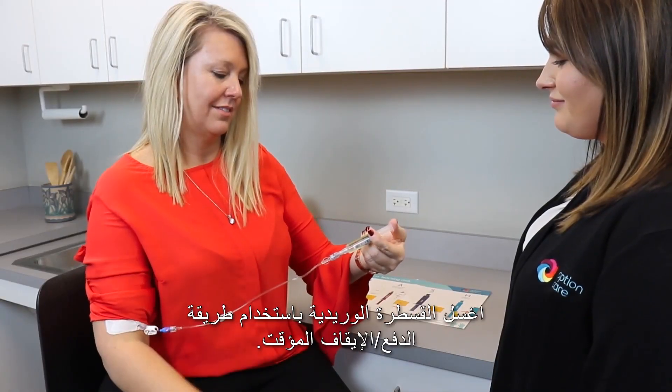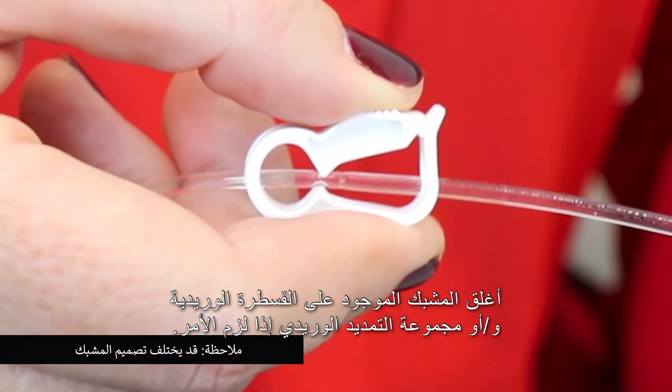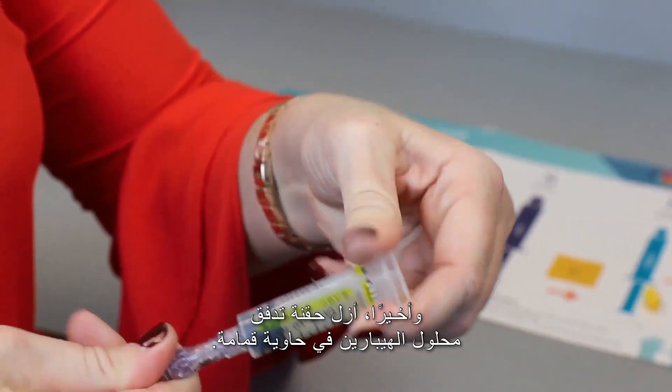Flush your IV catheter using a push-pause method. Close the clamp on your IV catheter and/or extension set if indicated. Lastly, remove and discard the heparin flush syringe in a trash container.